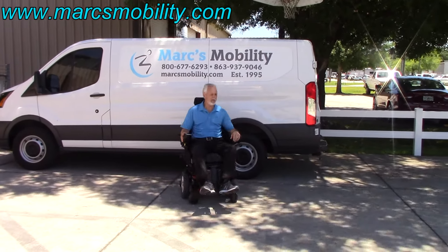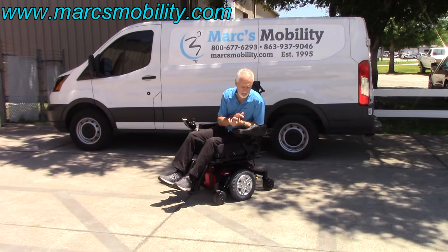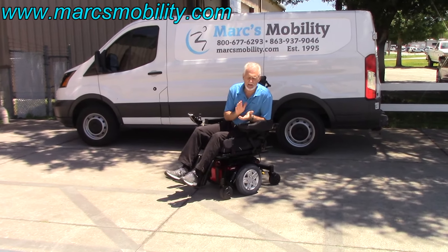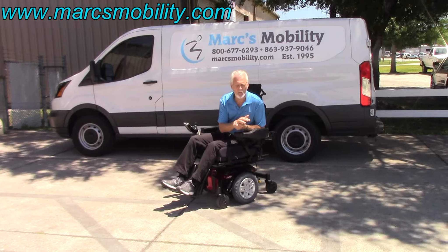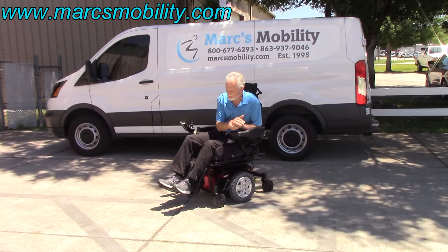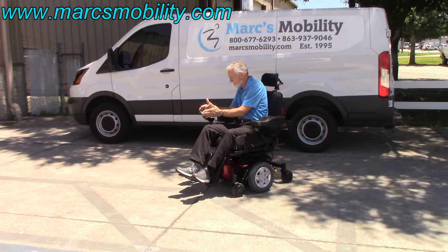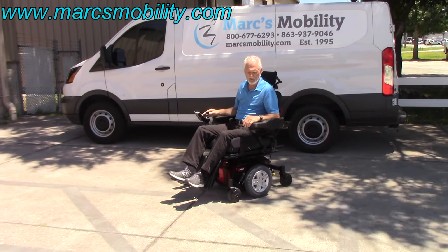This is the Quantum Edge 2.0 HD — heavy-duty with a 450-pound weight capability. Electric tilt, electric recline, electric legs. Top speed is 4.2 to 4.3 miles per hour. Great in the grass. A heavy-duty power chair in practically brand new condition with less than a mile on it. Ready to go.